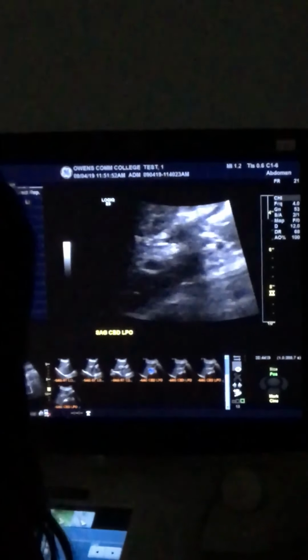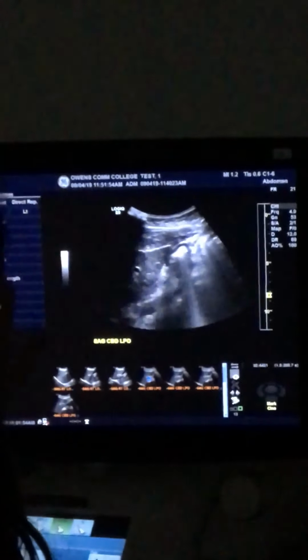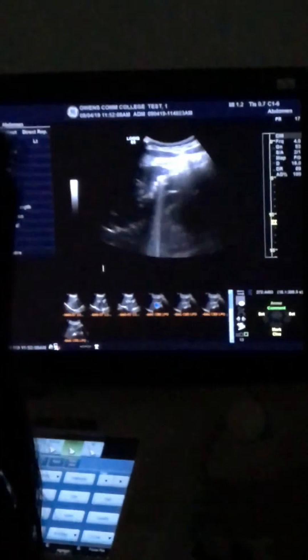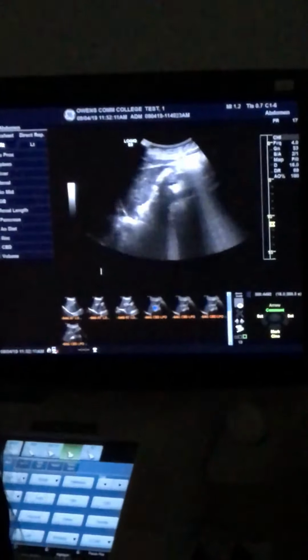Okay, so I deviated kind of from liver. We measured and looked at the common bile duct. Now I'm just gonna get back to liver. Okay, you can go ahead and lay back on your back so you can see more. All right, so we started here with long left lobe and went in. Then we went out and got dome, and we got lobar fissure, gallbladder, common bile duct. But that didn't cover this lower part of the right lobe because the right lobe is so big.